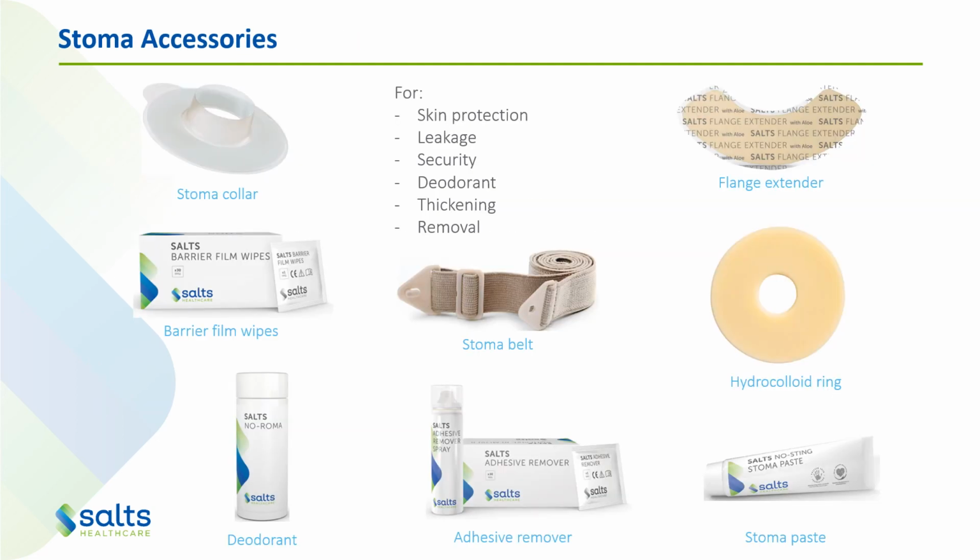As I mentioned, there are many different types of stoma pouches. There are also many different types of accessories, and these can do a myriad of things and include skin protection, leakage, security, and deodorant for putting into the bag to potentially help with odour. We've got thickening agents that help thicken up the output if we're worried about the output being really liquid and potentially causing leakage problems, or to make it easier to empty the bag so it doesn't get as messy. And we've got agents that can help with removal as well. But again, the best thing to do before using these is to talk to a stomal therapist who can advise on the best ones and how to use them.